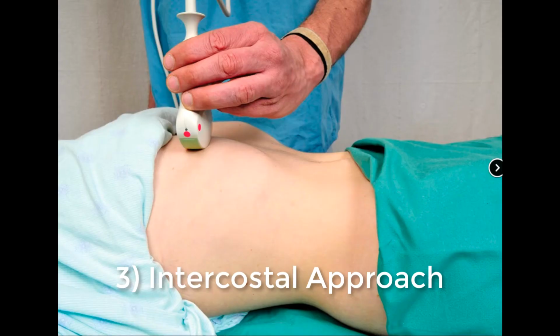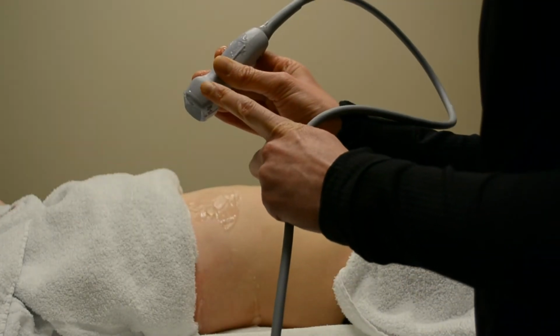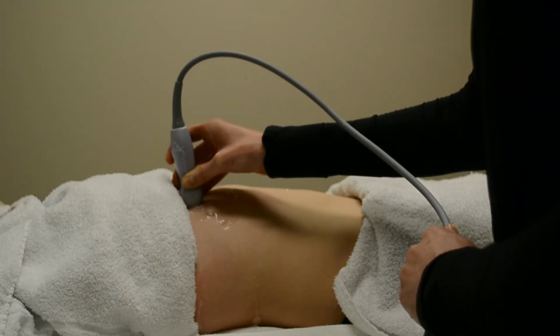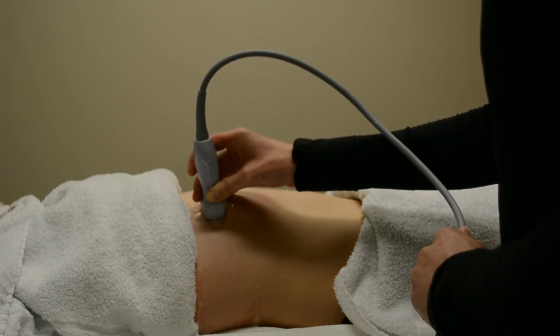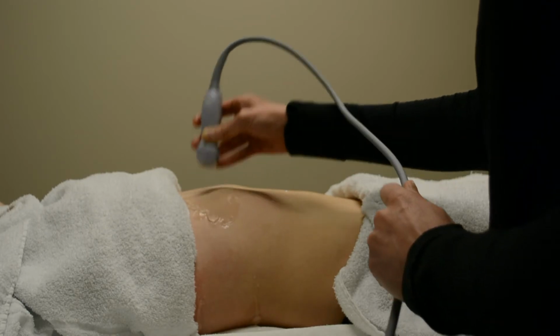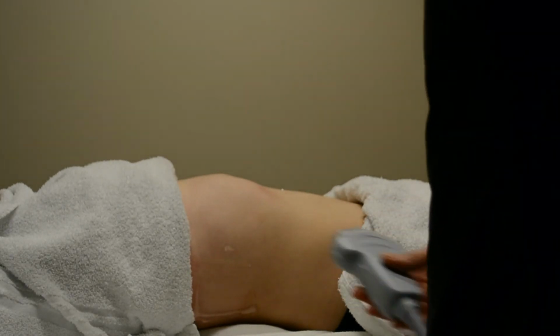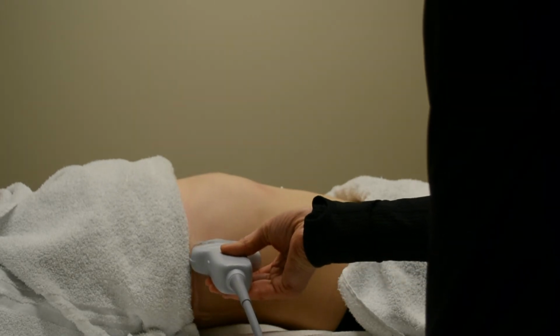Number 3, for high-lying gallbladders, you may attempt an intercostal approach. Place the probe in an intercostal space with the probe in the transverse plane. Start at the midclavicular line and move the probe methodically, first cephalad and caudad, and then medially and laterally while staying in an intercostal space. This approach may be easier with the smaller footprint of the phased array probe. And finally, for more lateral gallbladders, consider a lateral approach. Start by placing your probe on the right mid-axillary line in the longitudinal plane. Identify Morrison's pouch and then slowly slide the beam anteriorly until the gallbladder comes into view.